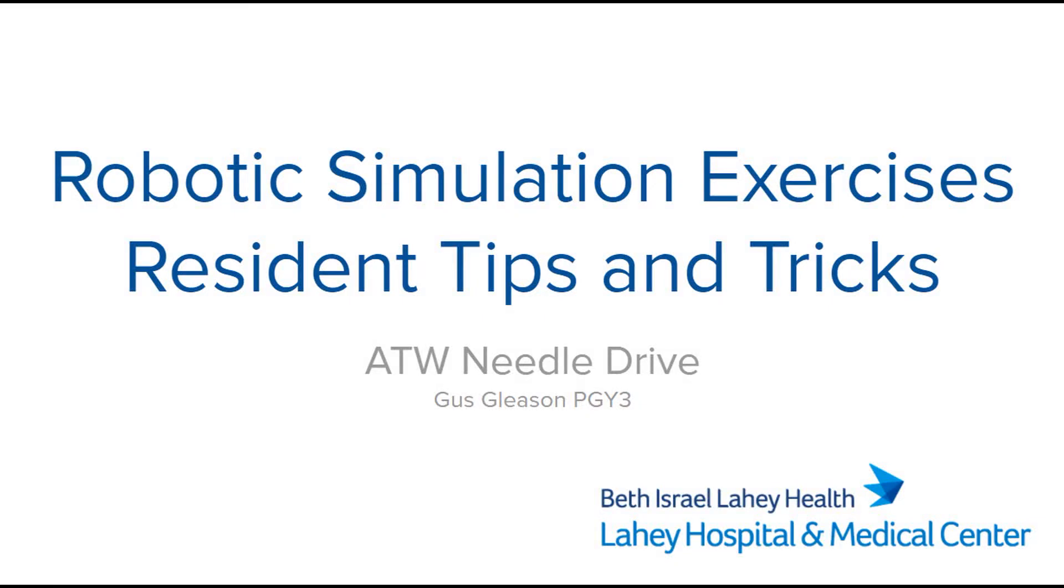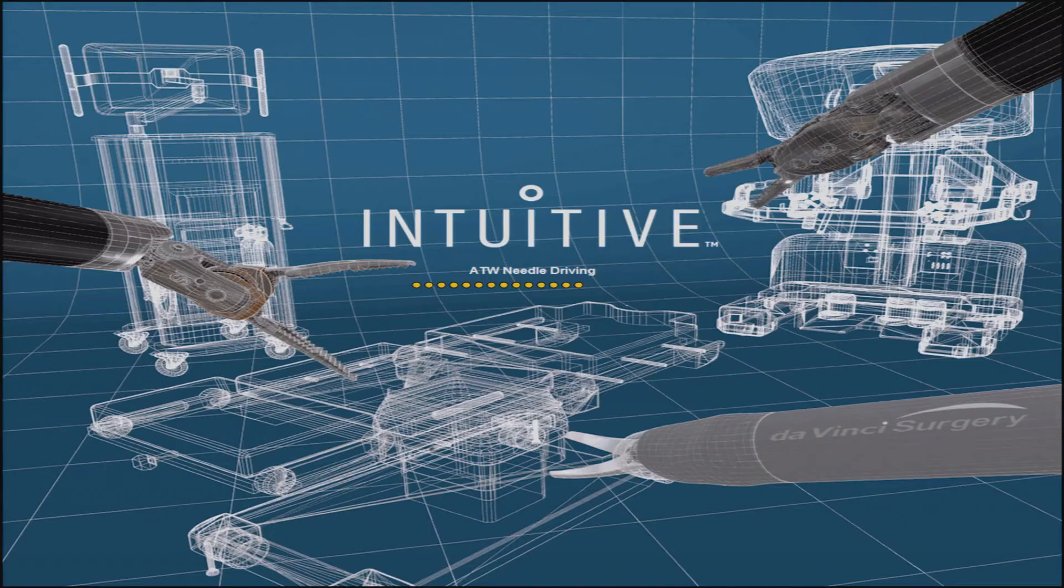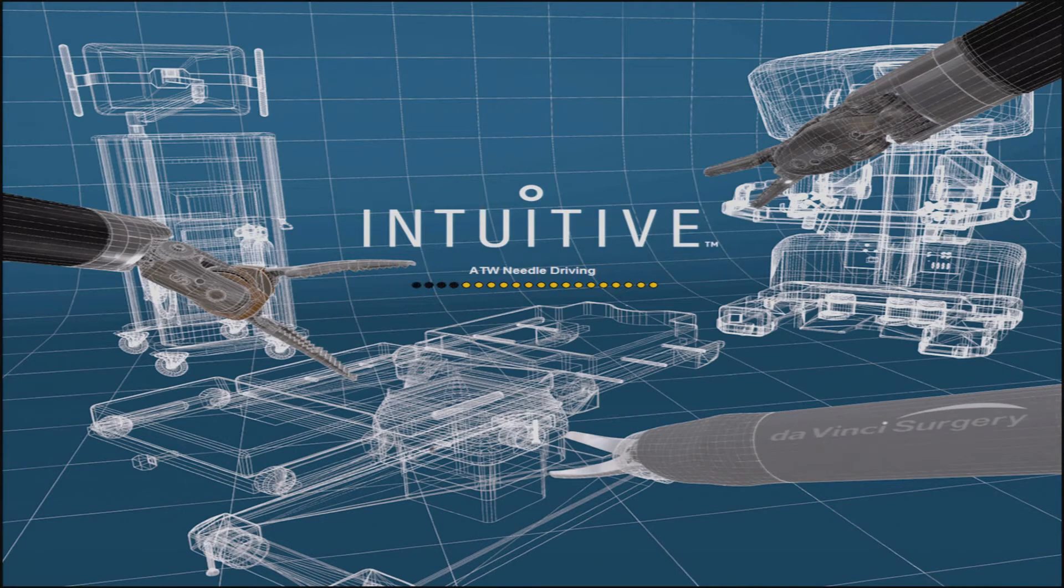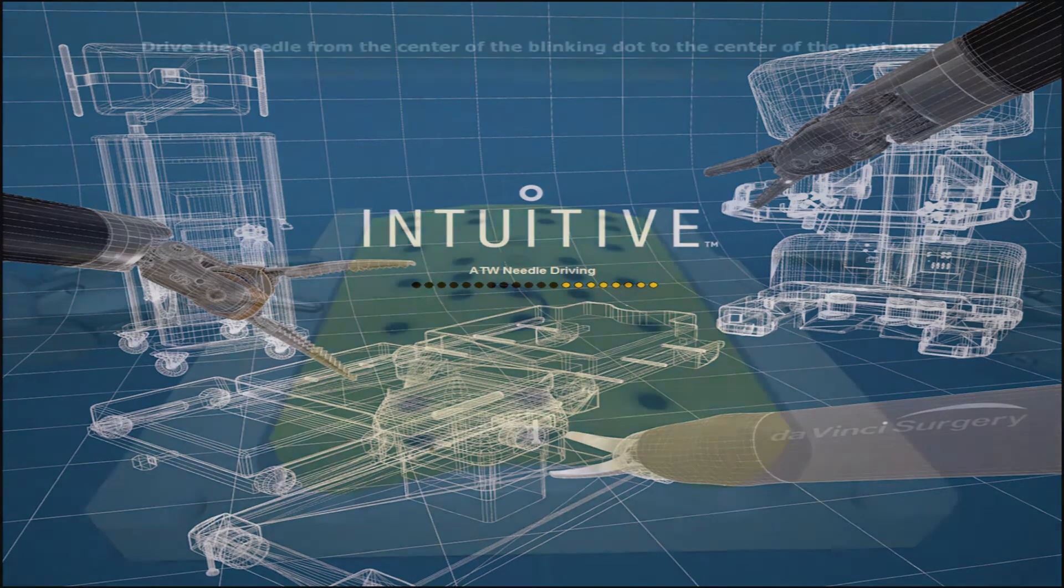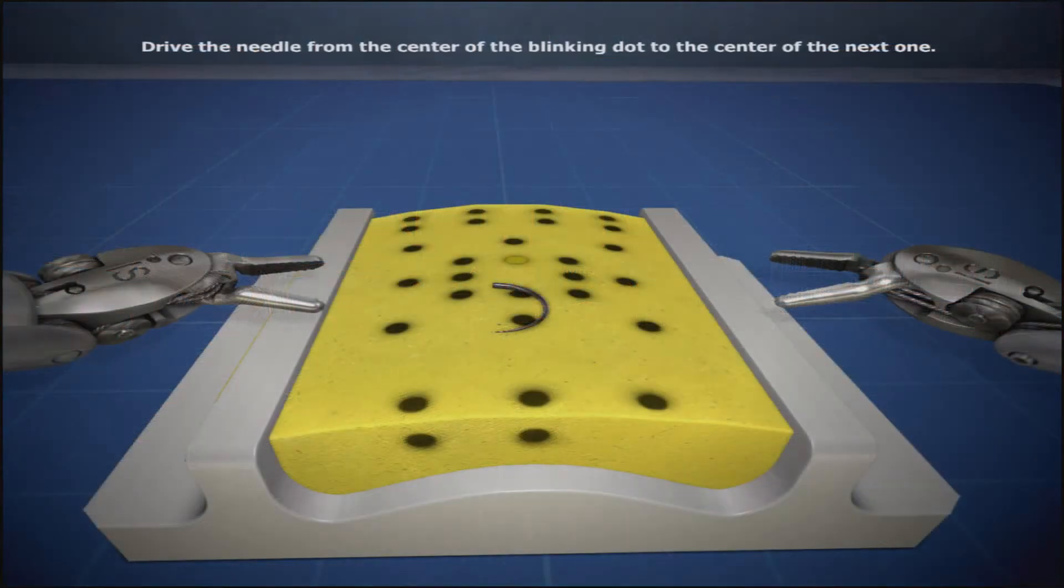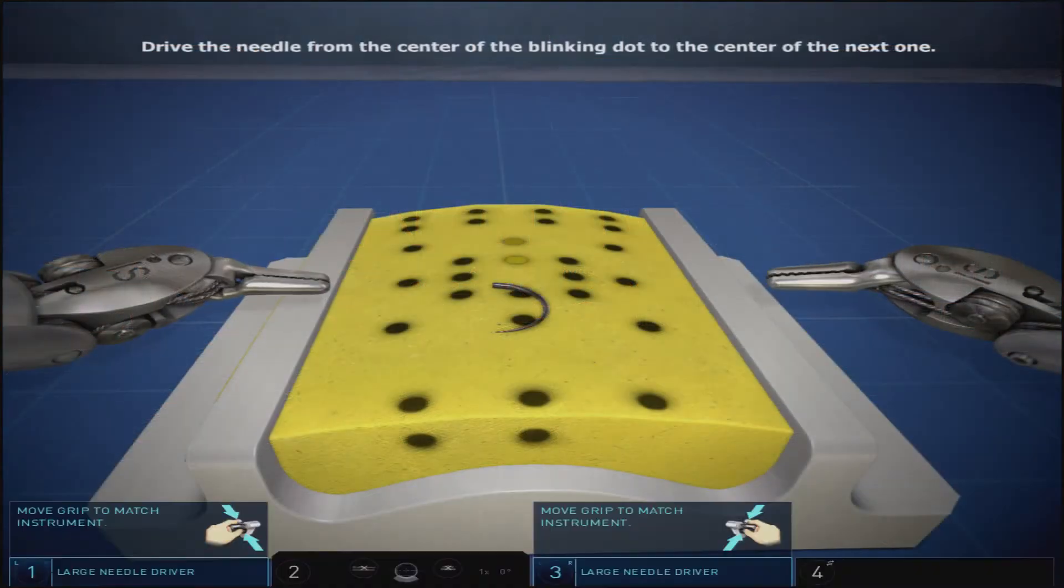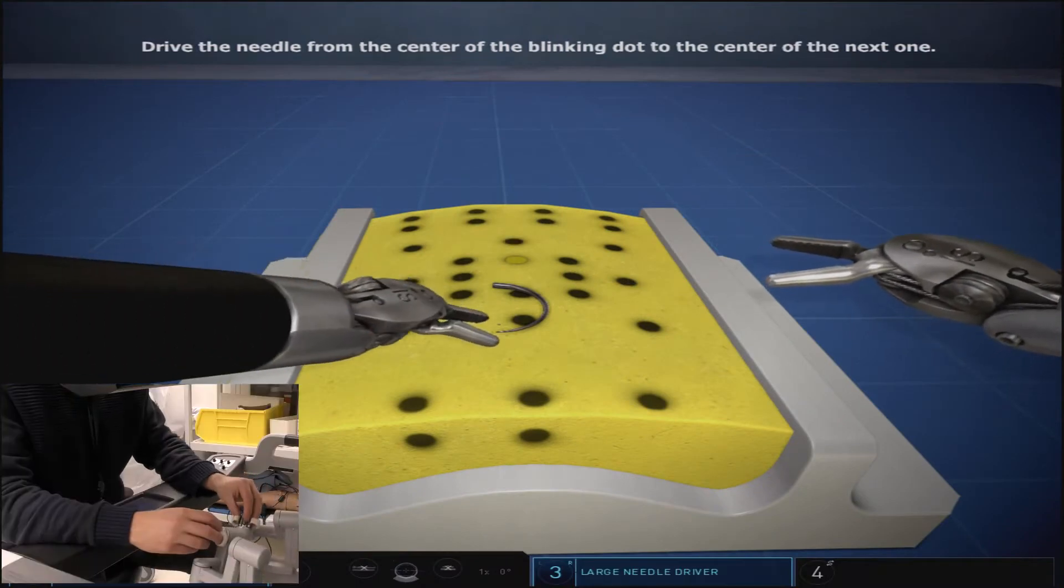This exercise is ATW or around the world needle driving. It is done on the foam simulated suture pad which is also used in the Big Dipper needle drive exercise.